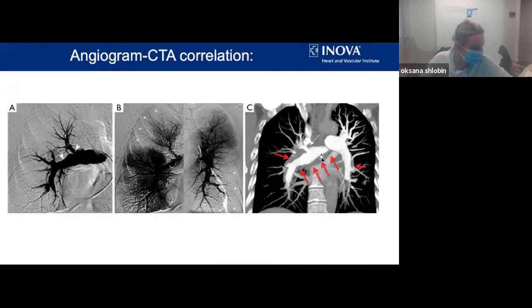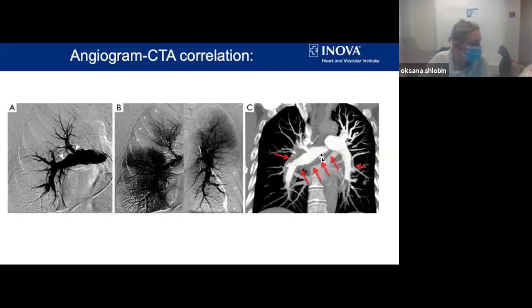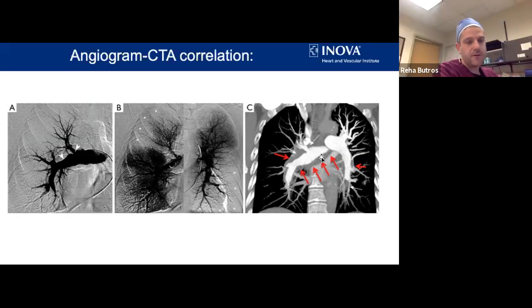So if they have distal disease, even if it may be surgically accessible, if it's segmental or subsegmental, sometimes BPA can have a role in management of symptoms, probably combined with medications. Sometimes we also do it in post-operative patients, and so it's increasing, and as we get better, we're going to do it more and more. But again, if the patient is relatively young and the disease mostly central, I would definitely defer to Dan for treatment.